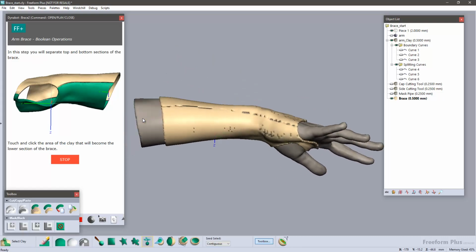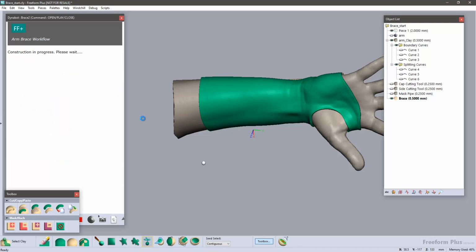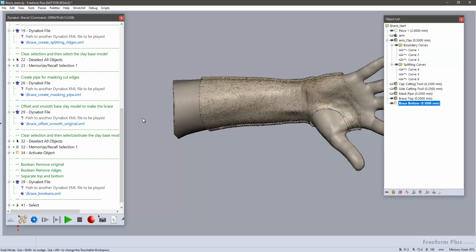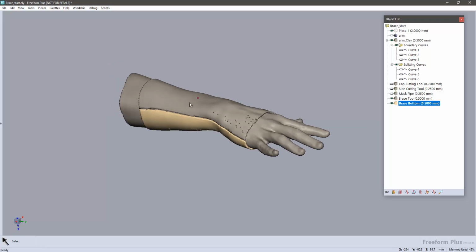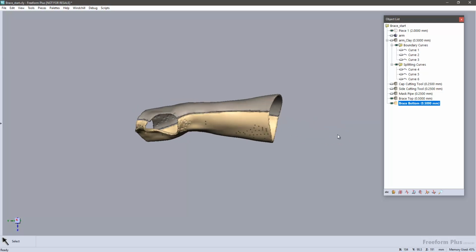So the last step is just like the previous one, where I look at what I want, touch with the stylus, and as soon as I click, it is performing a cut and paste, separating the two objects, renaming them, and the Dynabot is complete. This has been about 5 minutes, all said and done with my explanation, which without that it could have been faster. If I hide the arm, you can see that we have a wrist brace that is built of 2 separate pieces.